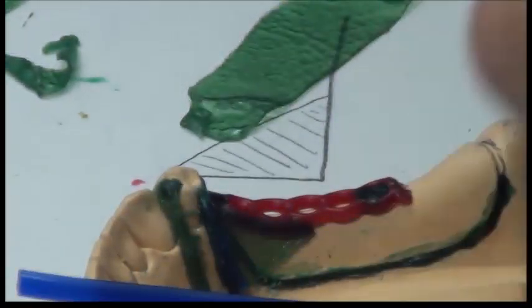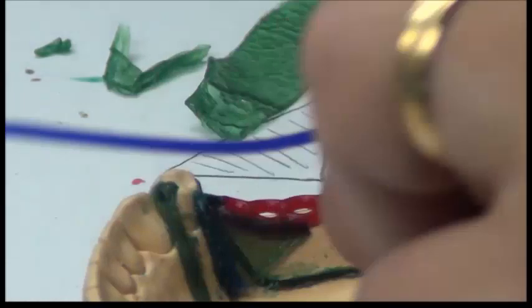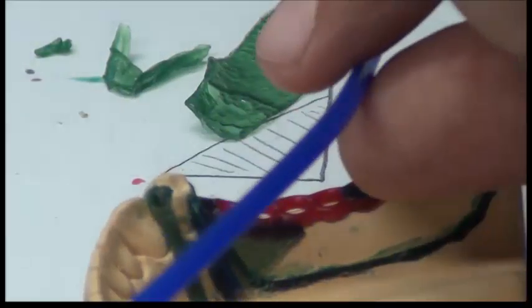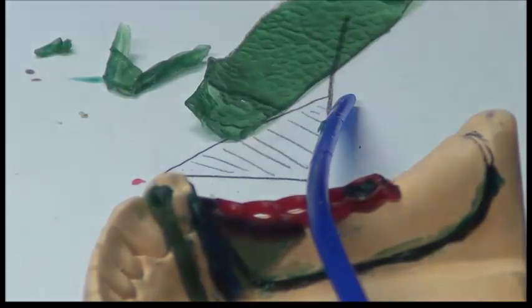You want to notice, as in the upper, remember that we said the upper has a shining surface and an irregular surface, and we said the irregular or rough surface goes upwards. In the lower, we need to know the surfaces of the lingual bar. We're not going to place a plate here today. We're going to place a lingual bar.